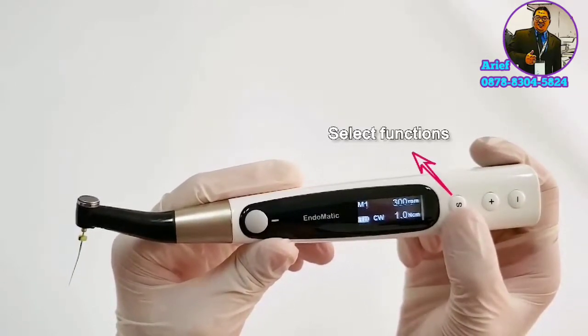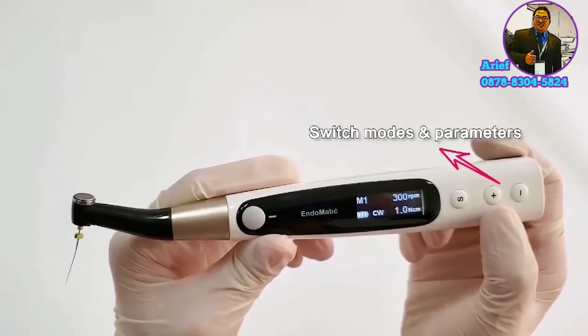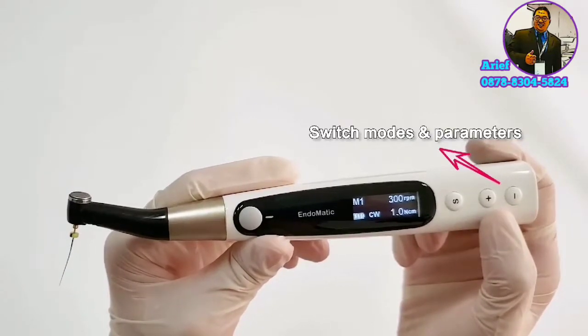We select different functions and parameters through these 3 buttons. Press the S button to select different functions, and press the plus and minus buttons to switch different modes and parameters.